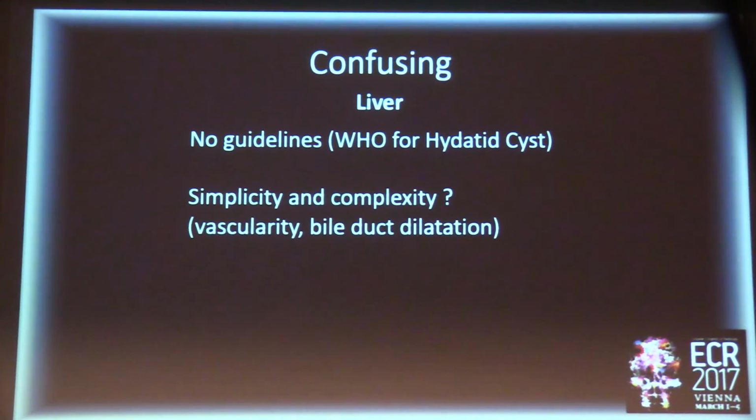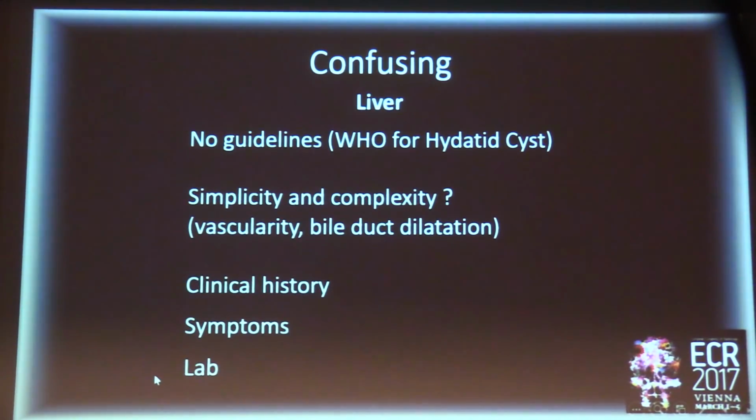That's vascularity, that's bile duct dilatation. Sometimes you'll just have to biopsy them. There's no other way. And always remember, clinical history, symptoms, and lab results are always important.